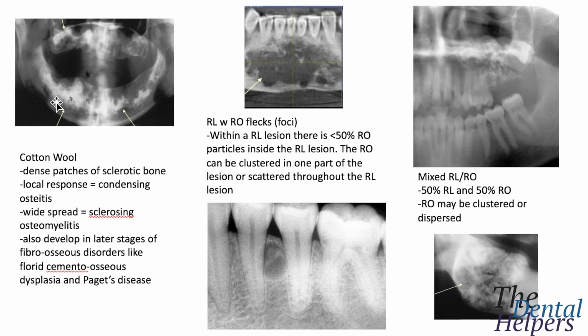You can also have it develop in later stages of fibro-osseous disorders like florid cemento-osseous dysplasia or Paget's disease. This is really important because Paget's disease comes up on the boards. It's also like a common test question.